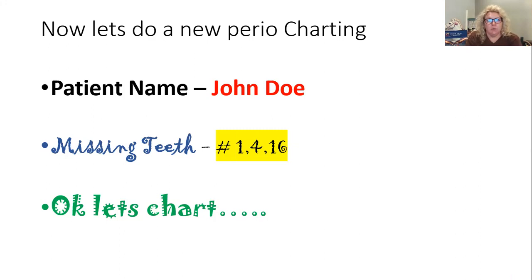So we're at the distal lingual of 15. 4, 3, 3, 3, 3, 3, 3, 2. Where am I?